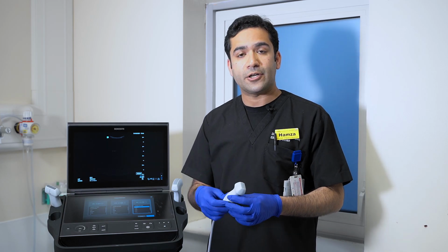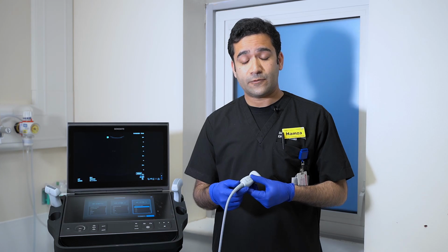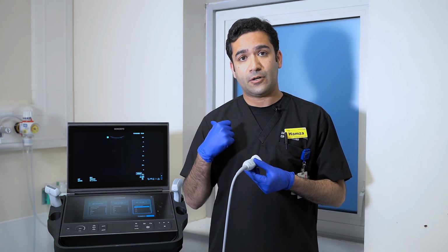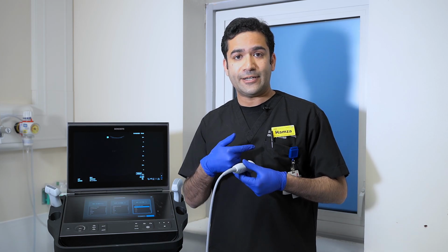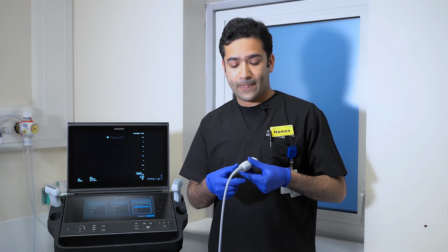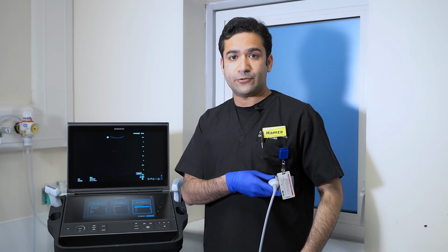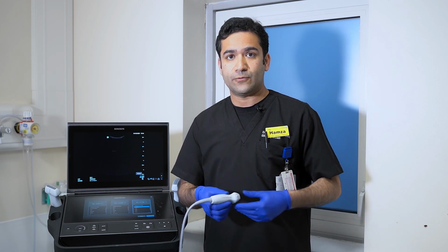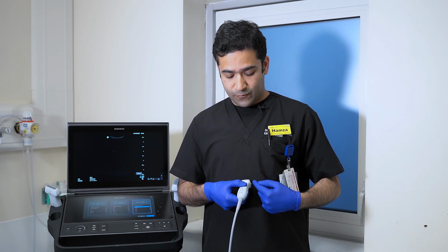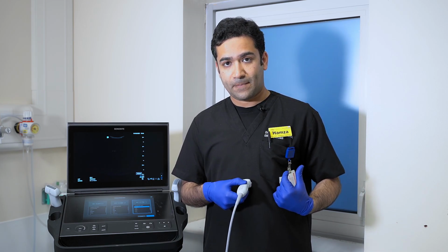which basically, depending on the view, so if you're starting off with the long axis view, it's going to be towards the patient's right shoulder. Then you move on to the short axis, it moves 90 degrees towards the left shoulder. For the apical 4-chamber view, it is again directed towards the left shoulder but towards the apex. And the subcostal view is, of course, in the subcostal region with the probe marker towards the patient's left.